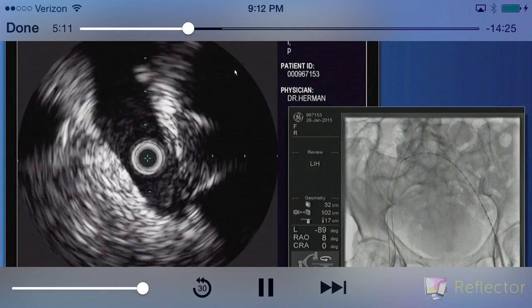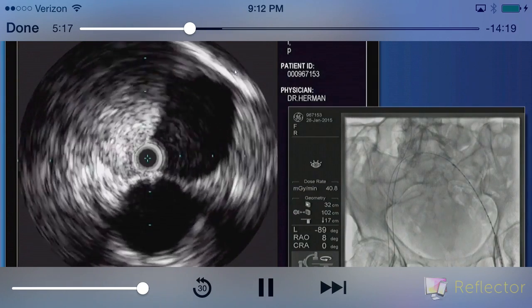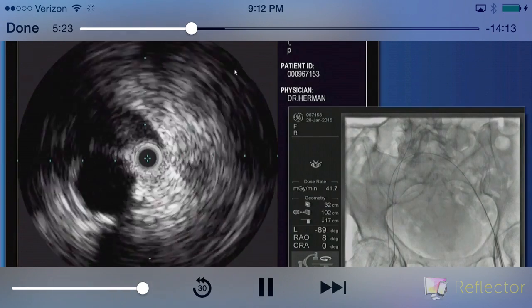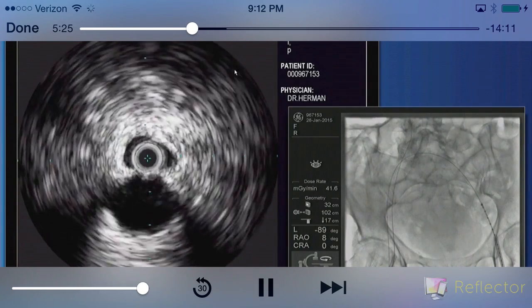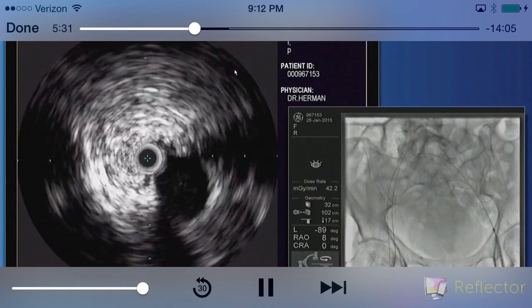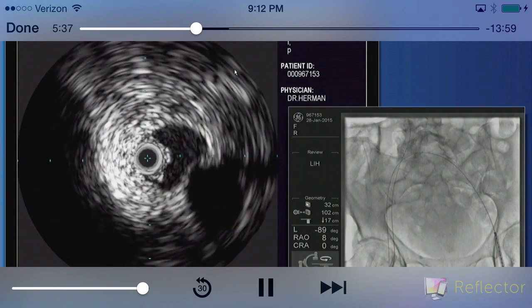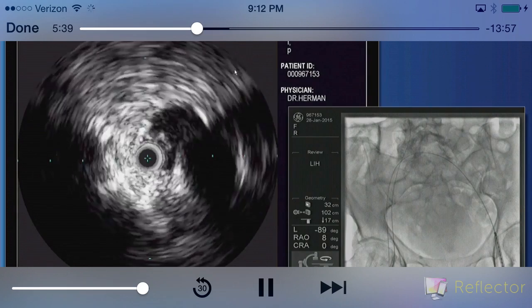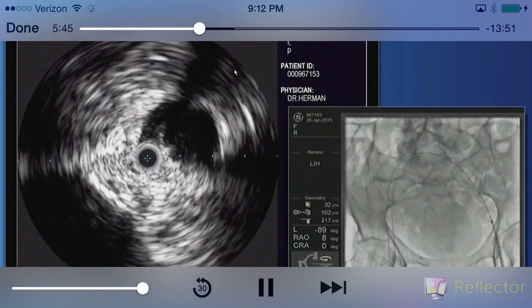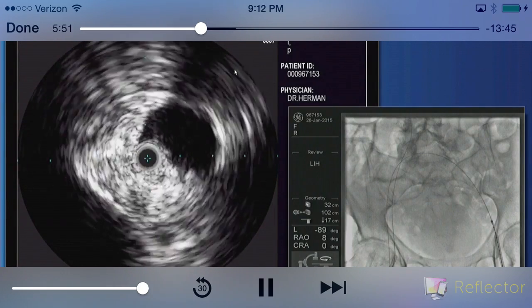Okay. What did you guys think of that IVUS? It still seemed like there was an area in that external that looked compromised. And now we're coming back through the left side. Well, the problem with the ultrasound like you do it is because you have it bent, the wire itself is going to stretch the vein flat because you have tension on the wire, and that will always cause the vein to flatten because you just put it to the lateral side. So that's a little bit of a disadvantage of using the IVUS in this direction. At least that's our feeling if we do it like this.